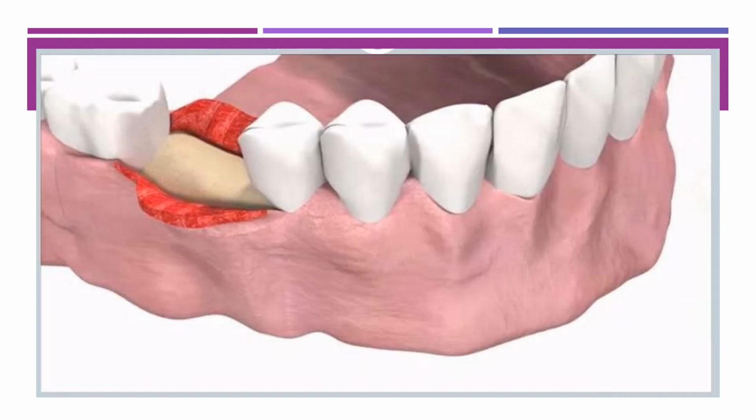You can see that here we have elevated the flaps. For better visualization, you can go for retraction, and you can also go for suturing. The elevated flaps can be sutured to the buccal mucosa or the opposing tooth to keep the surgical site open during the surgery. The bone at the implant site must be thoroughly debrided of all the granulation tissue. So that is important.